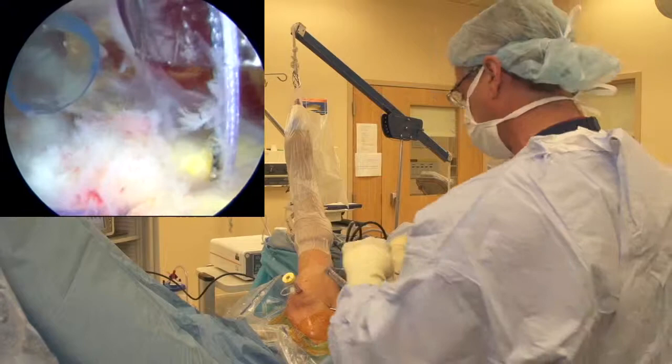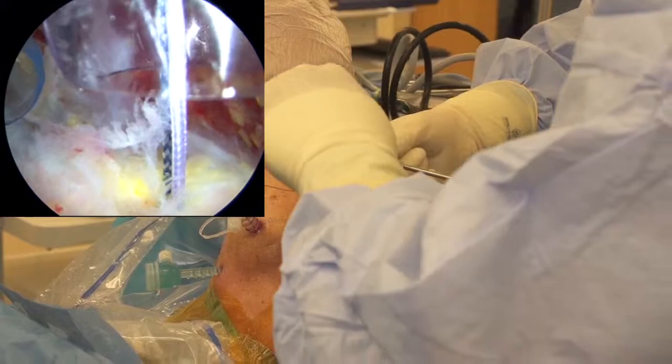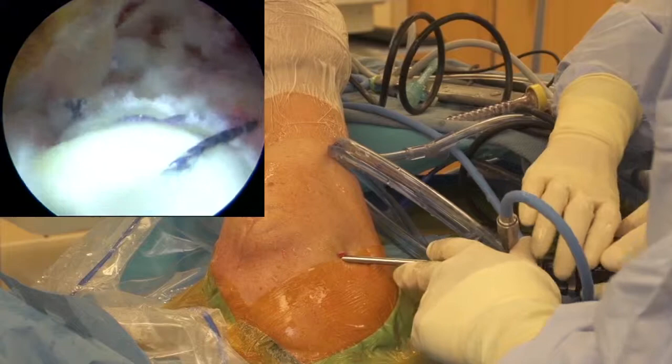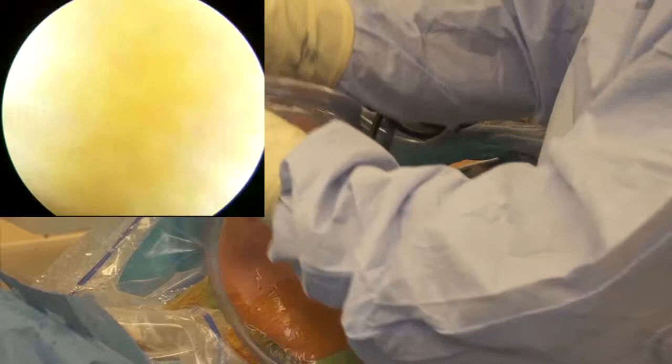Because of the rigidity of a construct like this, I have really advanced my post-operative protocols. We're allowing these patients to start early range of motion exercises immediately - post-op day 10 we're starting active assisted range of motion. I anticipate having them near full forward flexion and abduction by six to eight weeks with fairly aggressive rehab. You can see how nicely that footprint has really been restored. This is an anatomic repair - and that's a beautiful repair, complete coverage of the humeral head and the footprint.